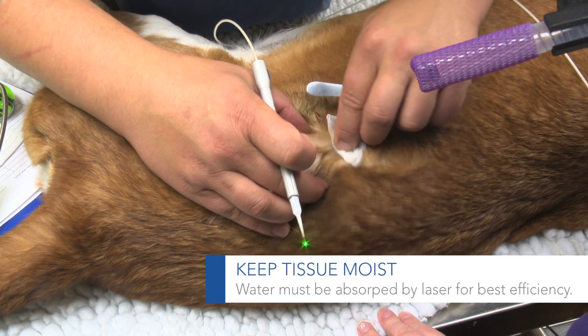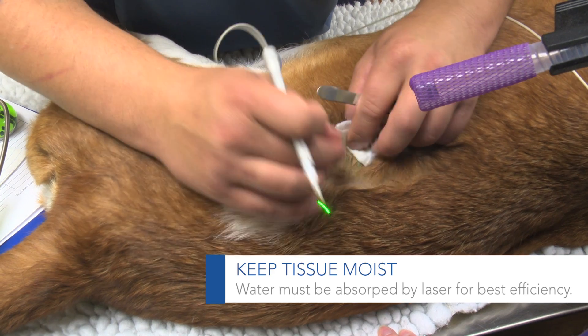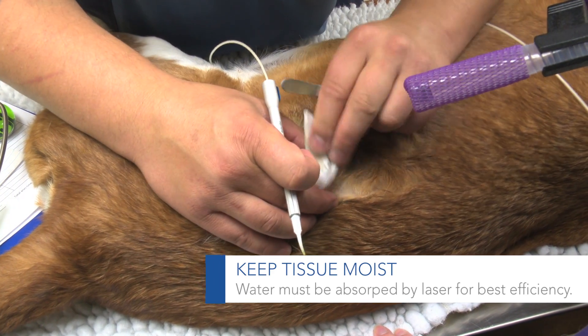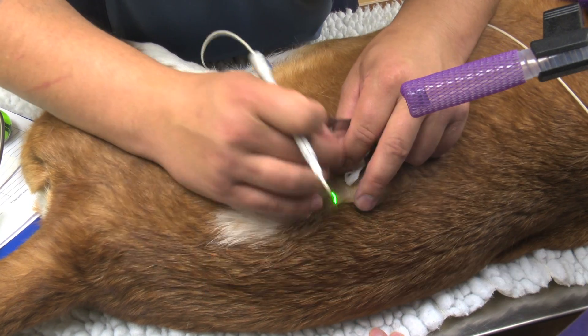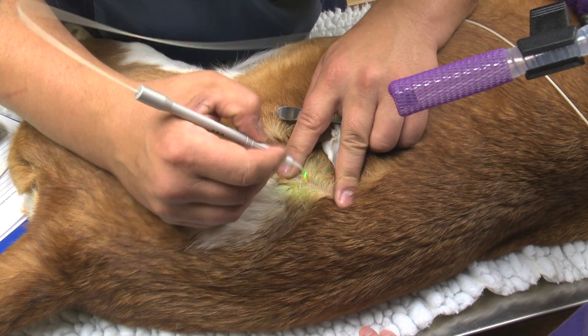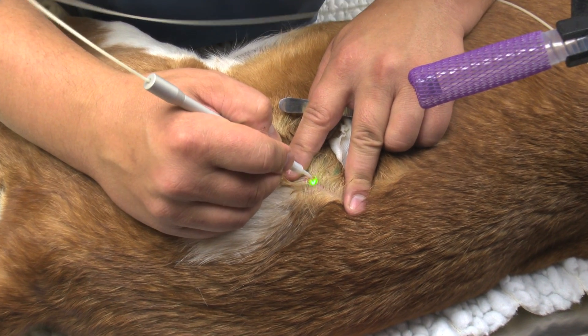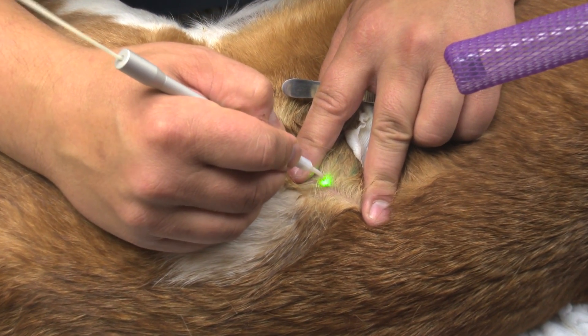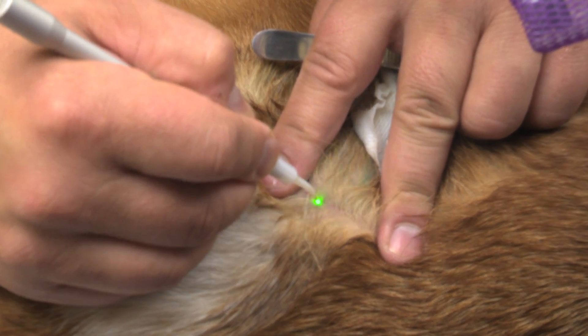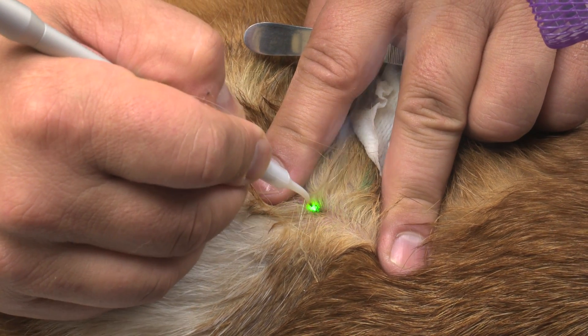Wiping is very important, because the tissue needs the water in it to be absorbed by the infrared light. It helps, as opposed to just going over and over eschar — the caramelized tissue. It'll just be more efficient for you.